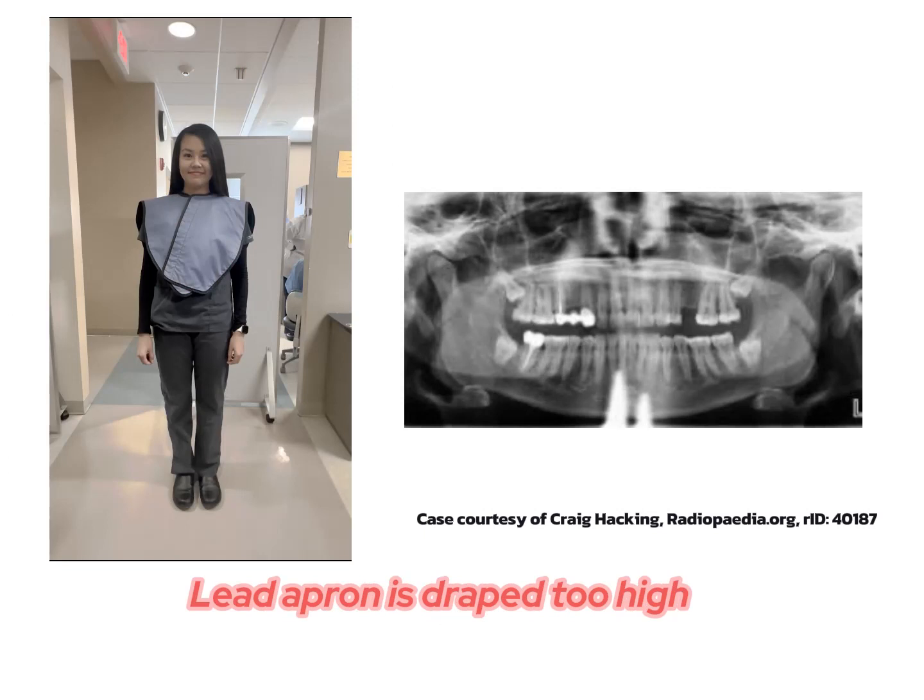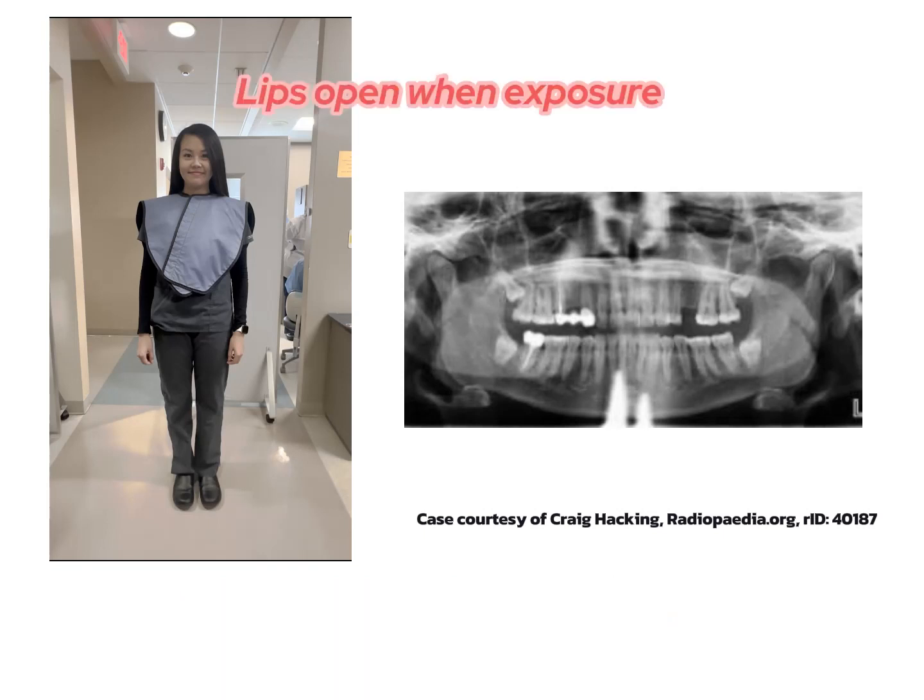Lead apron is dropped too high on the patient. Result: triangular opacity on the bottom edge of the radiograph. To correct this issue, the clinician should use a double-sided lead apron without a thyroid collar and drop the apron down around the neck and back area.